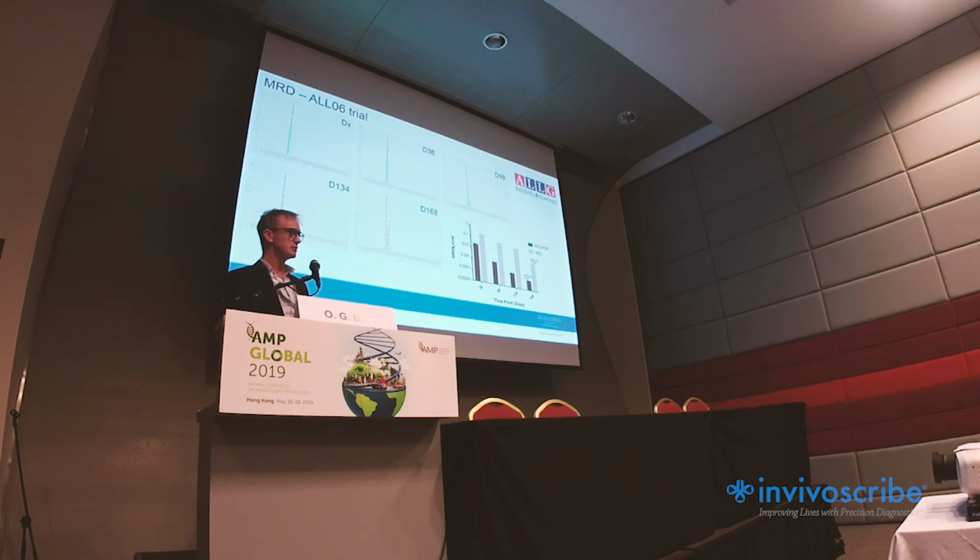But the issue with that is that at the time we didn't have an internal control, so we were unsure whether that was actually a significant difference or whether we were going to have to normalize this. But we were confident that at least at that time point it seemed that it was a sensitive assay.